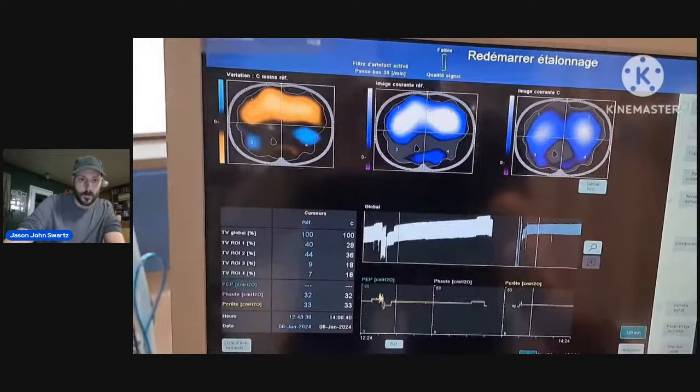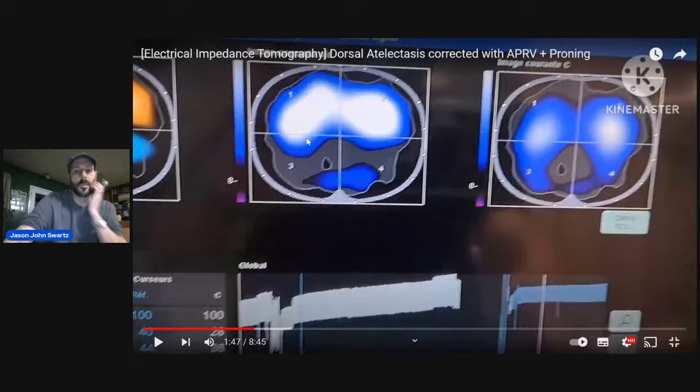Do you see here now? So this is now in the prone position. So now the chest is lying down. All the body weight is here now. So we can see that there's less distribution, and this is strictly a positional change. So all of a sudden there's less distribution going to the ventral areas.